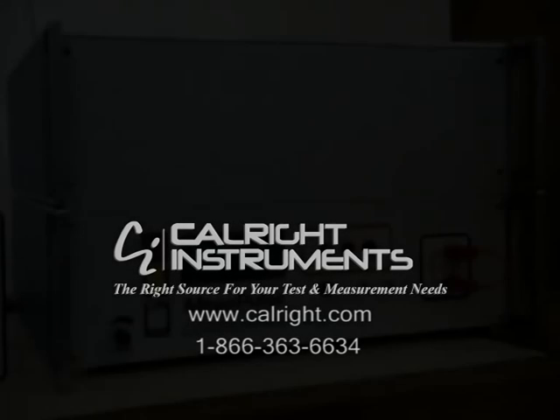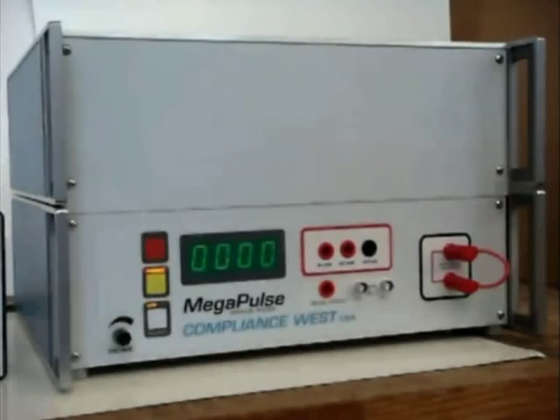This video will discuss the method used to set up a test with the D-Fib 5 and check the setup with our pass-fail reference. First, some information about the D-Fib 5.